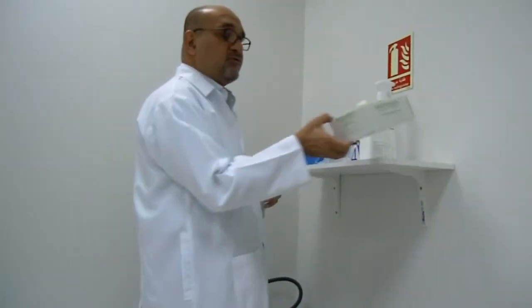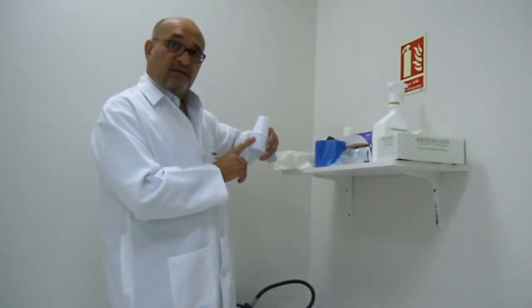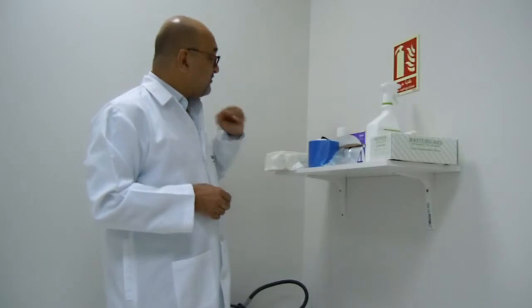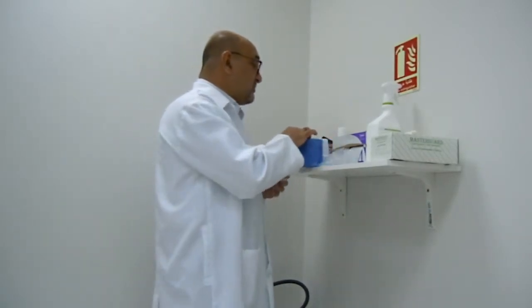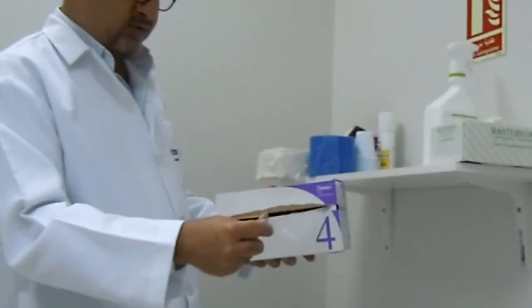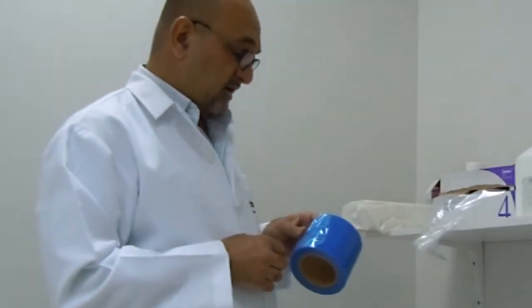Second, make sure your gloves are available in the size you are going to use. Third, you should have a set of cups where you will place the films before and after exposure. If you don't have cups, use disposable tissues available on a separate desk. You should also provide infection control barriers — like the x-ray covers, which are the same as dental chair headrest covers. All of them are disposable.